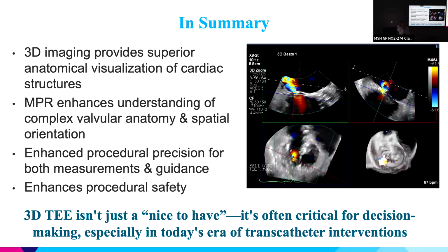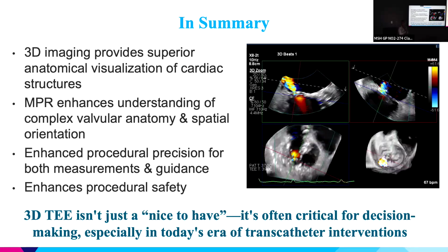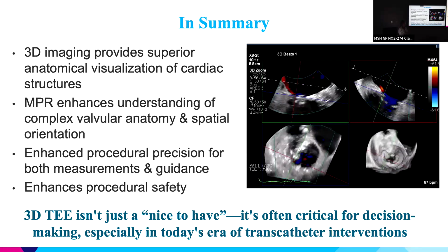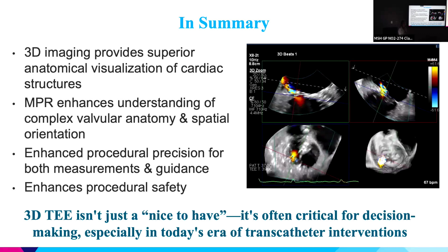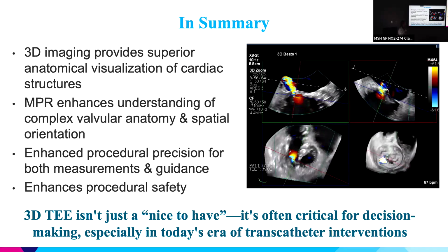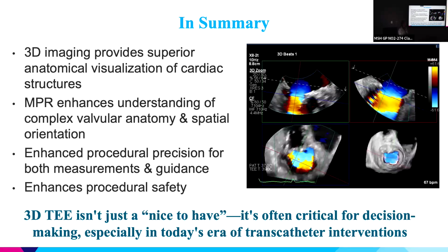So in summary, 3D imaging, it's pretty awesome. I think that it's not anymore something that's nice to have on your echo. I think especially now that we're doing these structural procedures, it's more mandatory. And so, you know, practice when you can, especially if you have a free machine, and I'm here to help with any questions.